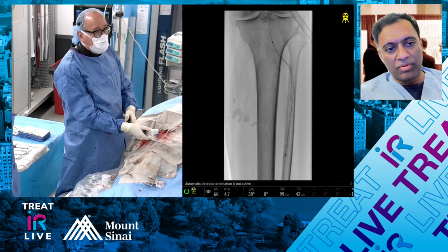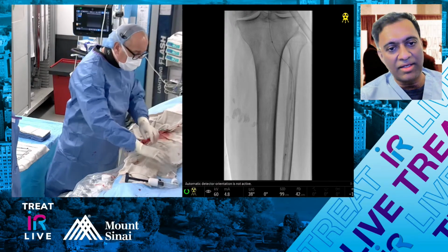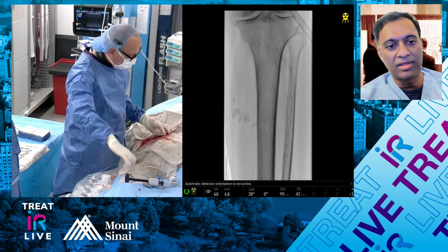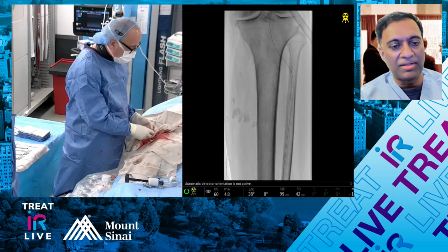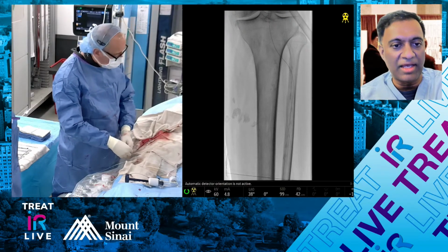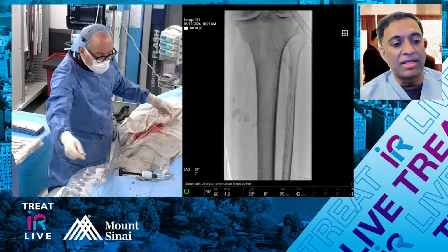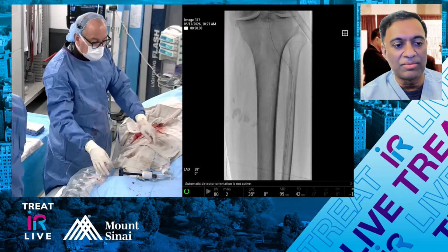So, I used to do more orbital atherectomy, and now that's gone way down. I rarely use it unless I can't cross. And so I'll kind of vessel prep it with a low profile balloon just so I can get the shock, the lithoplasty technology, down. But I use it quite a bit in the FemPop and tibial and even the iliacs now with the larger diameter ones they have. So would you say it's like 50% of your cases, more? Maybe more than 50%, because we're seeing a lot of dialysis patients, so they're pretty calcified.